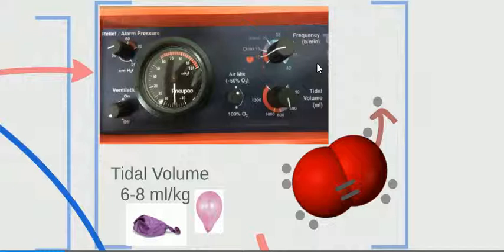This whole thing is supposed to be used to get rid of hands. So you got hands off the patient, you don't have to bag. But for patients under 12 years of age, we don't really use it. So we've gone through a couple things so far: tidal volume, frequency, and FiO2. Those are the three main ones that I really want you guys to focus on.